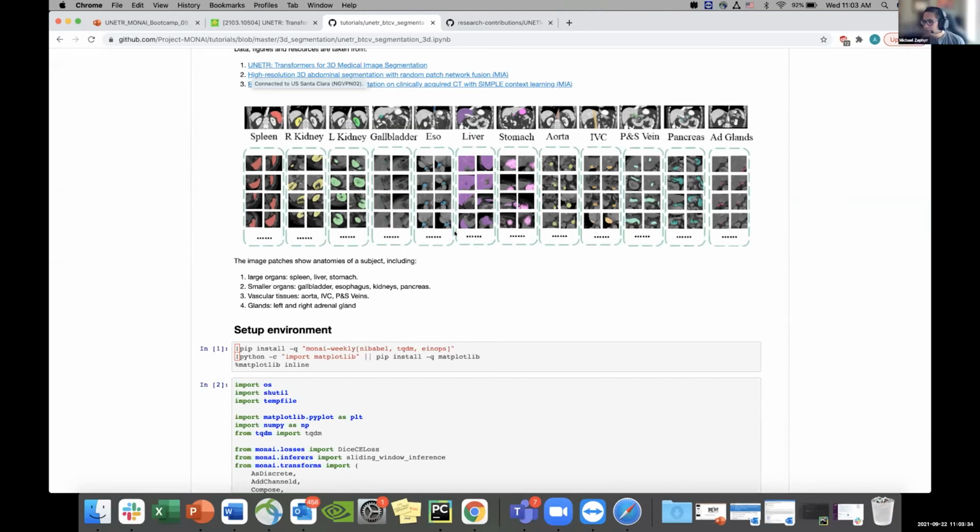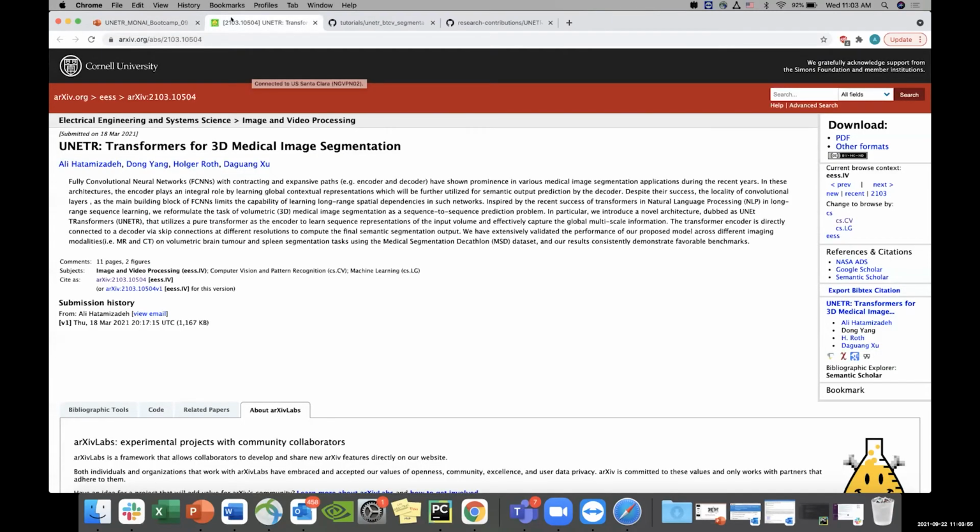Great. There's a few more here, I think another 2 or 3. How does UNETR perform for the segmentation or detection of very small abnormalities, lesions? Did you perform any experiments about that? Well, that's also another great question. I hope I can show the slides back on, but we showed that for very small organs, our model performs better than nnU-Net and TransUNet. A good example of that is the adrenal glands in the BTCV dataset.